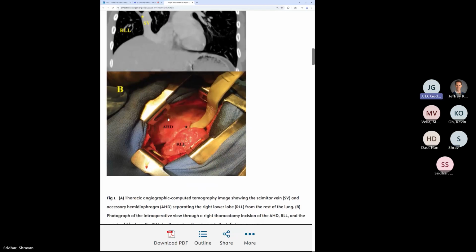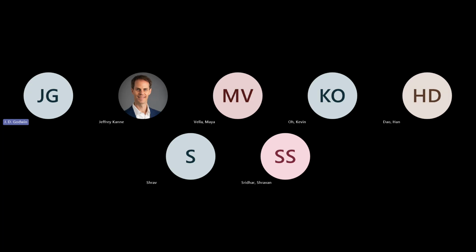This is a really rare condition in association with scimitar, but there are a lot of misdiagnoses of it in the old literature. In the 90s, I read all of the old articles about scimitar, and a lot of people were making the diagnosis of accessory hemidiaphragm based on a retrosternal stripe that really reflected the mediastinal rotation because of a small right lung. This was all from the pre-CT days. There had been an article about accessory hemidiaphragm, and one of the findings was that the person was extremely messed up, who had accessory hemidiaphragm and had a small right hemithorax.